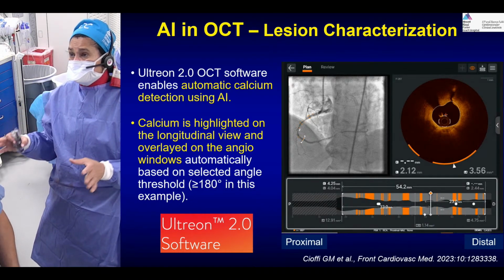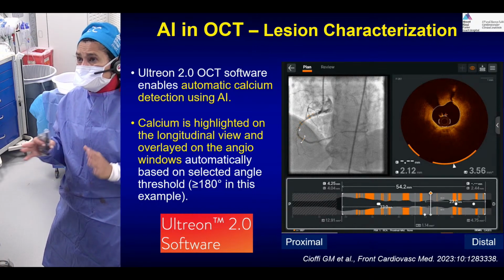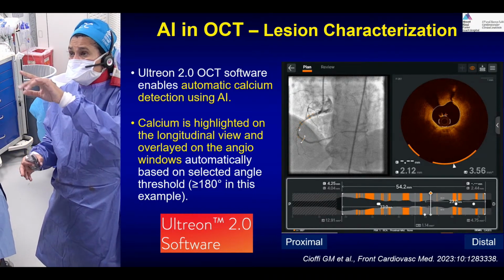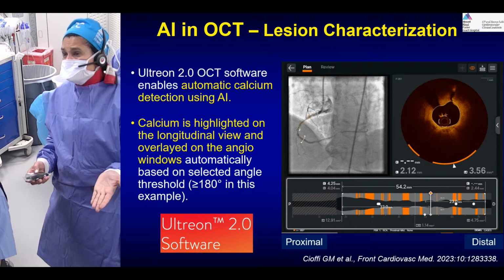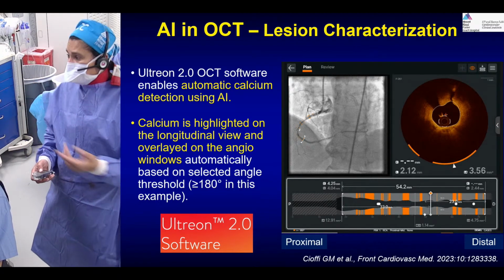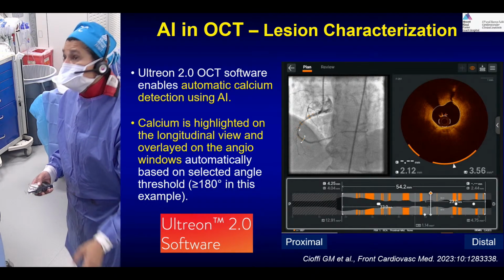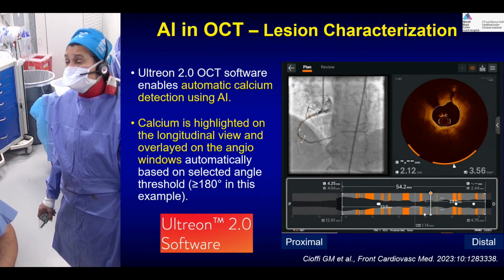Okay, very simple. So for people who are in private practice, if they want to do something like this, do it, and you understand how much calcium is there, and it gives you all the numbers, which should be very easy to understand. Kiski, do you want to add anything here? No, it's perfect. But still, we need some human eye to modify it. So it's not fully automated.